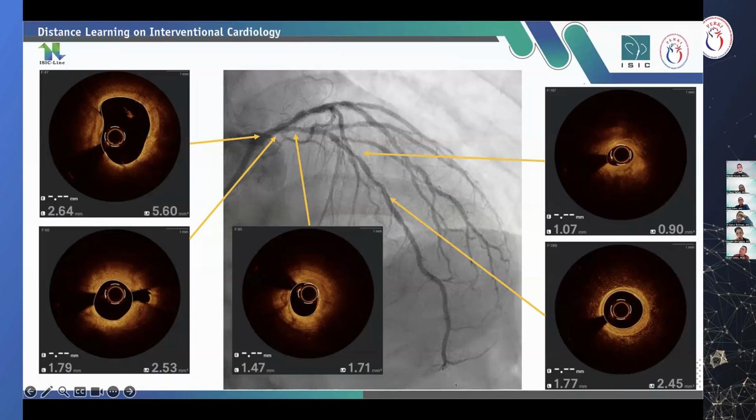Yeah, I prefer the second one. In our daily practice, I prefer the simple approach of putting the provisional stent, and then another DCB could be applied. As we appreciate that the ostial circumflex is supposed to be safe, I wonder whether the shifting could happen. Then we might reassess using OCT whether there is disturbance of flow in the circumflex.